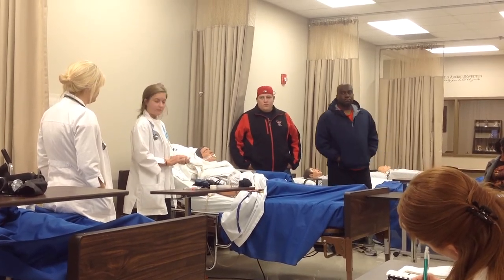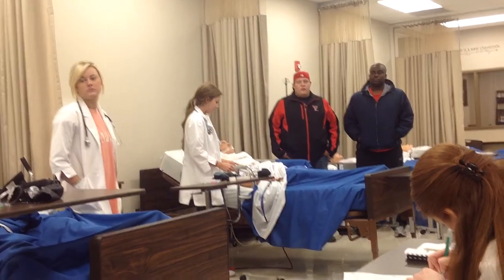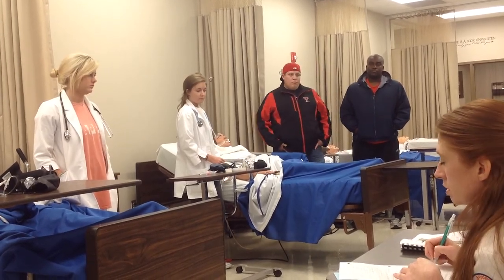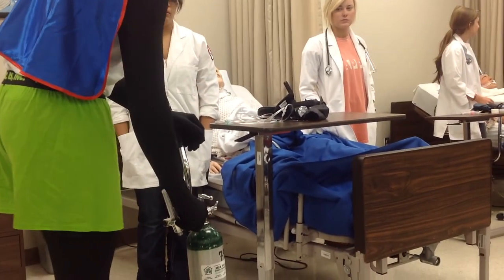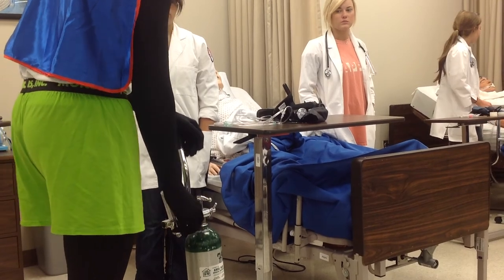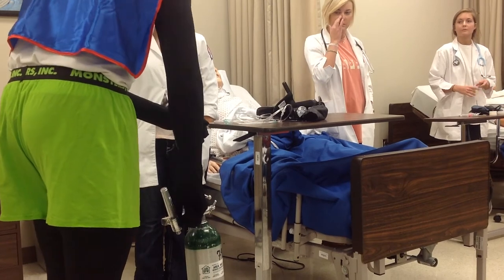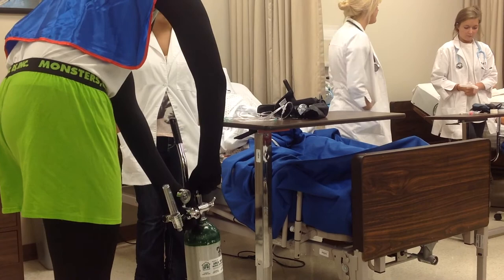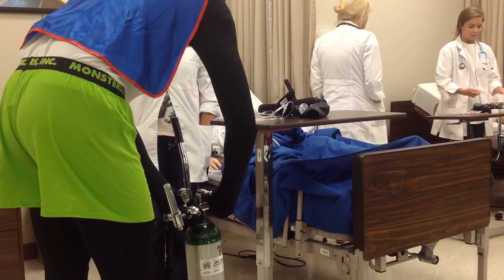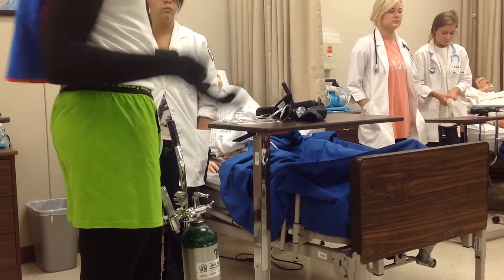Okay. We just have one last thing. When you are done with oxygen and you're putting up all your supplies, of course this has been on, so there's going to be some air in the regulator. What you want to do is turn it off, make sure it's sealed off, and then bleed the tank. You just turn up the dosage and let the air come out. You'd want to do it from where you set your dosage instead of at the actual point of connection, because you heard the little bit of air. If you do it from right here, it sounds much more dramatic, so you have more air, and if you had a spark or something, it would be a huge explosion rather than a little one.